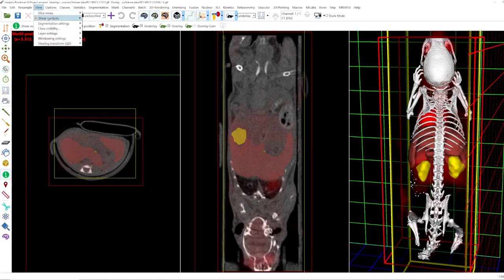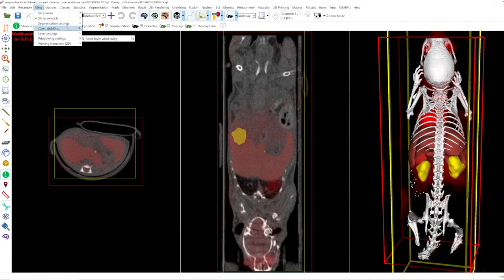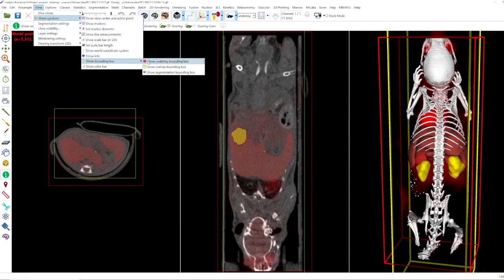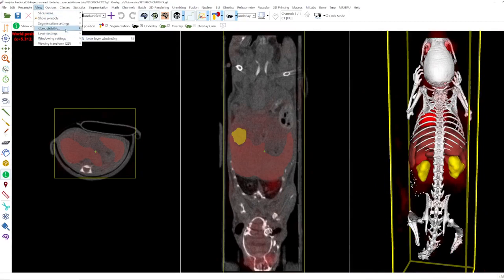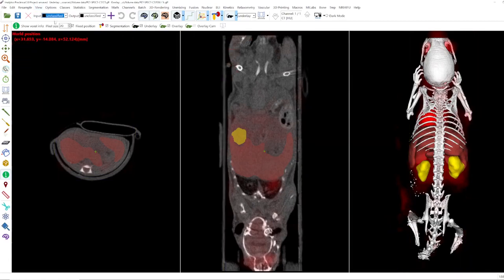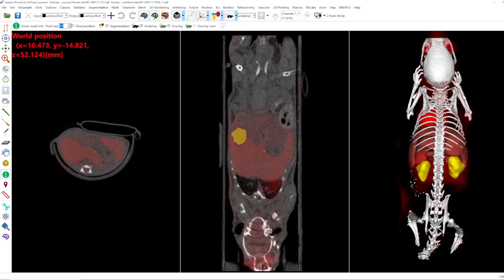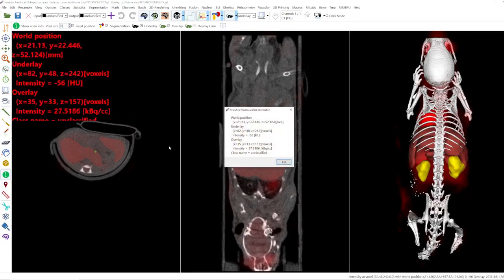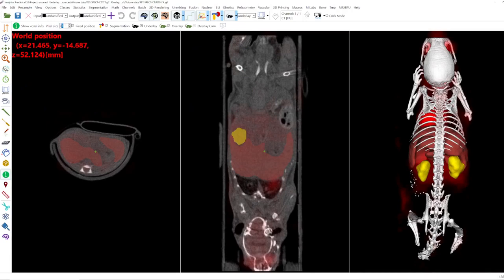That covers the coordinate system and the underlay and overlay system. I'll close it again because it looks too complicated this way. We have a special mouse settings toolbar for this mouse action. One setting is called 'Pixel Size' — here you can enlarge the font size. For example, with a larger number you get a larger size, but only for the hover text, not for the text in the box. I'll go back to 20.